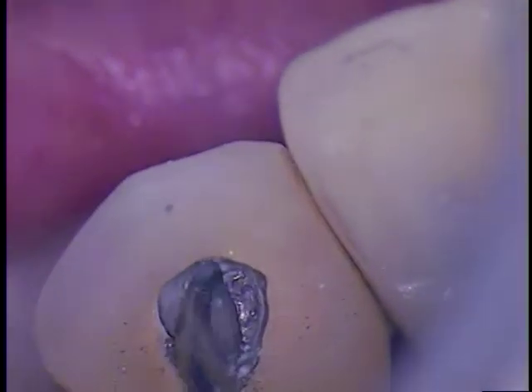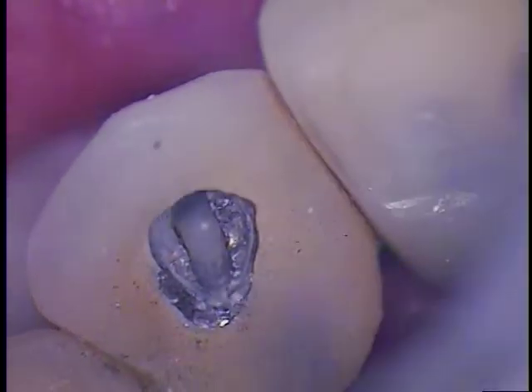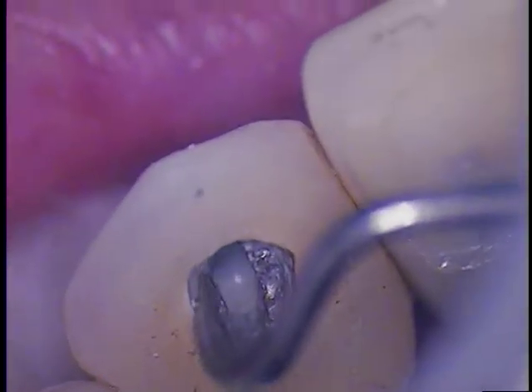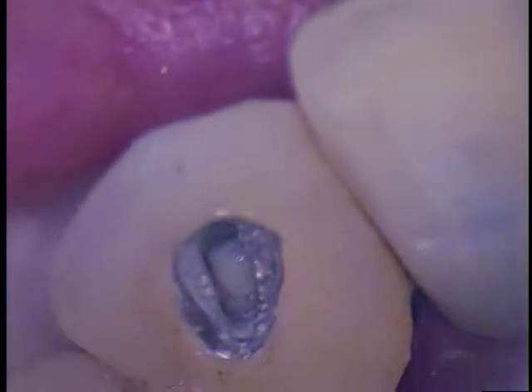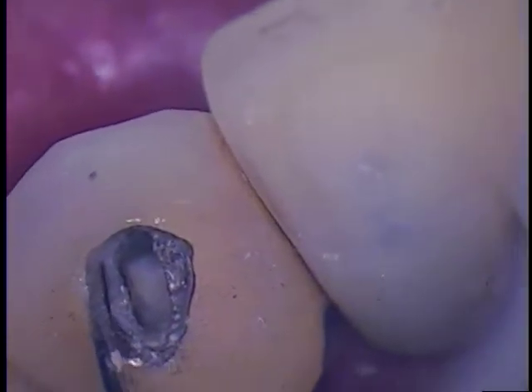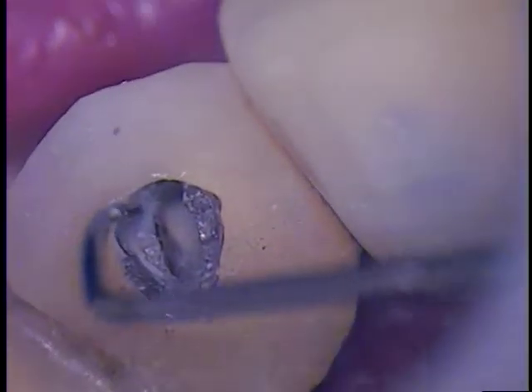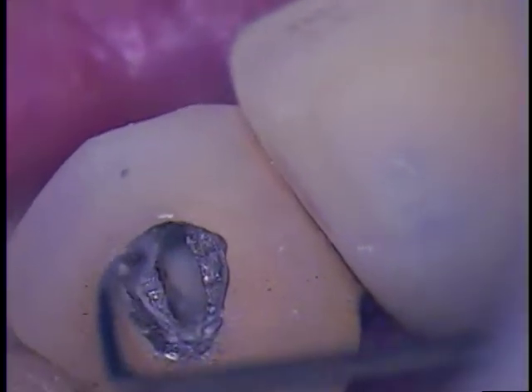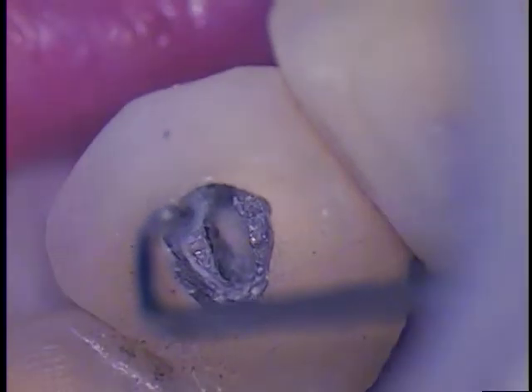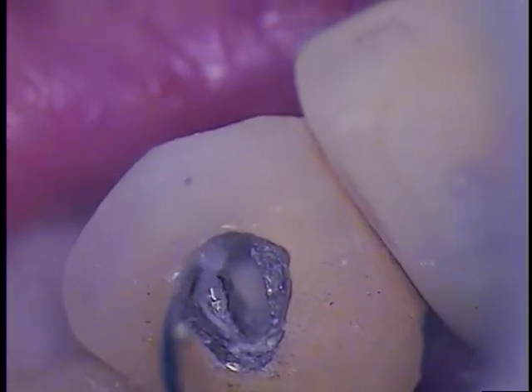Now I'm taking a scaler and just working it. In order to get — because I know it's a loose screw — perhaps we might get some separation between the abutment itself and the crown. I'm just pre-soaking it. It's a term I use a lot — pre-soaking — trying to get things to loosen up.